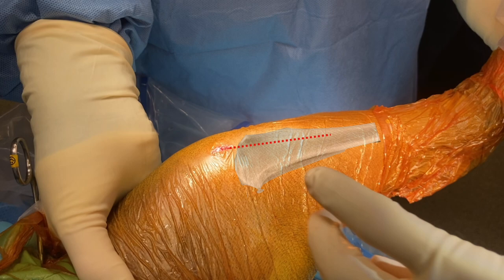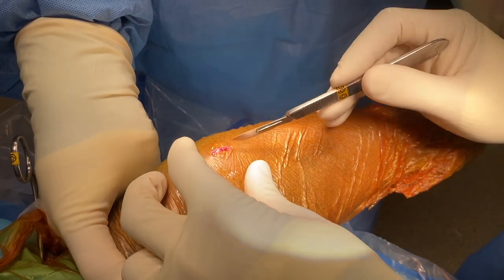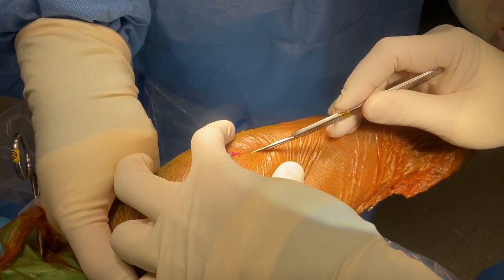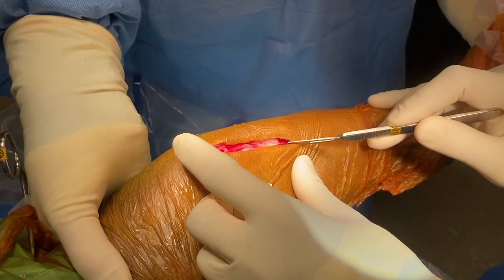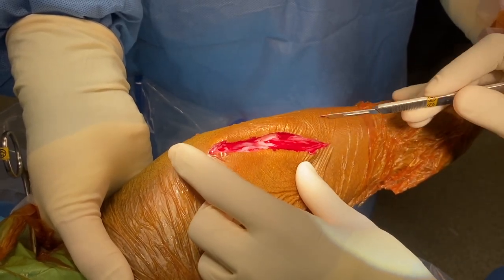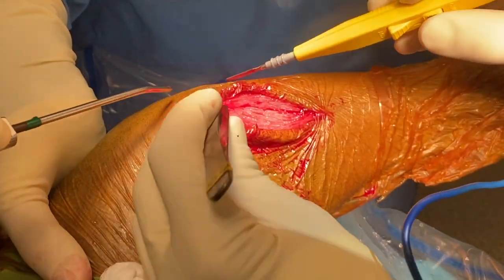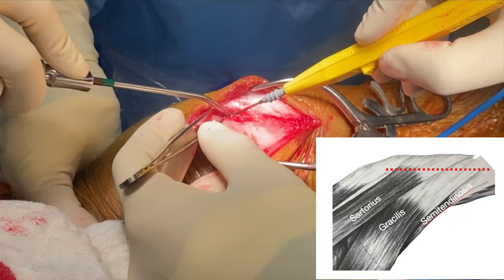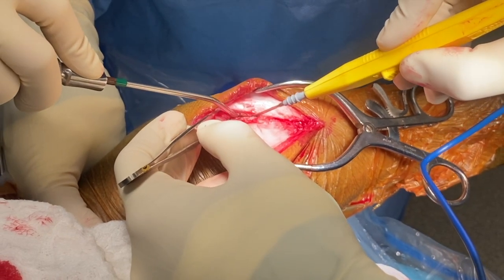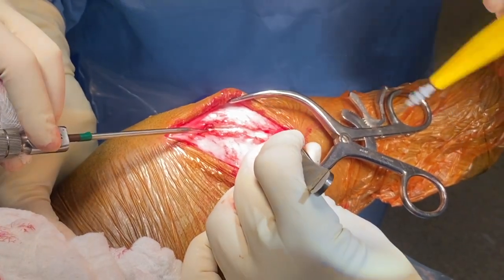Following joint exploration with arthroscopy or an arthrotomy, a skin incision is made parallel to and approximately one centimeter behind the cranial border of the proximal tibia. Cutaneous hemorrhage is controlled and the subcutaneous tissues are incised. The common tendon of insertion of the sartorius, gracilis and semitendinosus is sharply incised at the same level of the skin incision, about one centimeter from the cranial border of the proximal tibia.